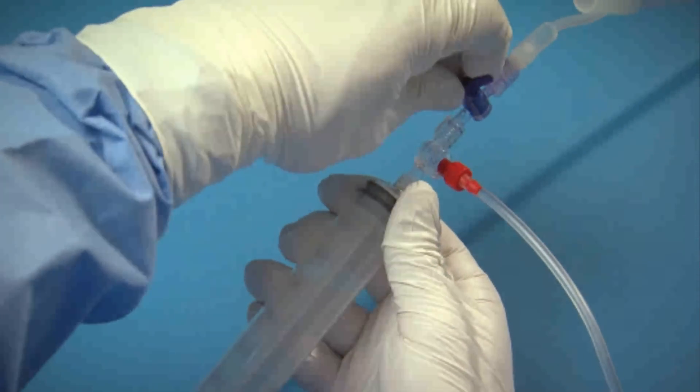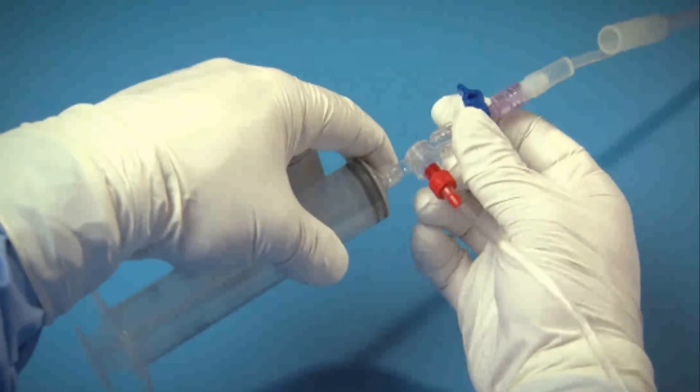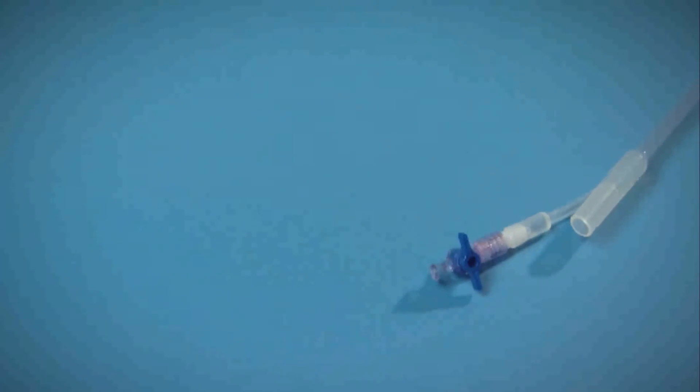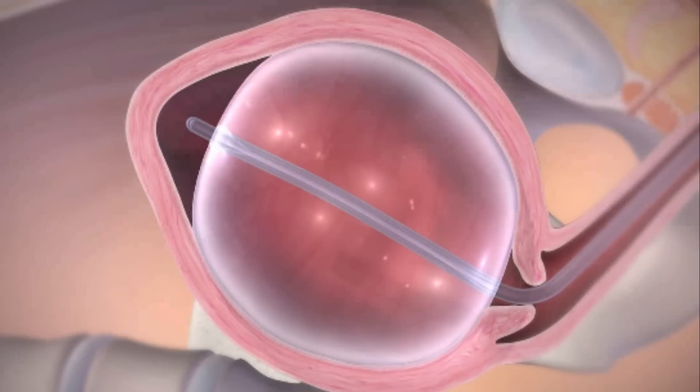Once you have inflated the balloon to the desired volume, close the stopcock on the Bakri balloon and remove the rapid installation components. Remember, the maximum indwell time for the balloon is 24 hours. It may be removed sooner if hemostasis is determined.